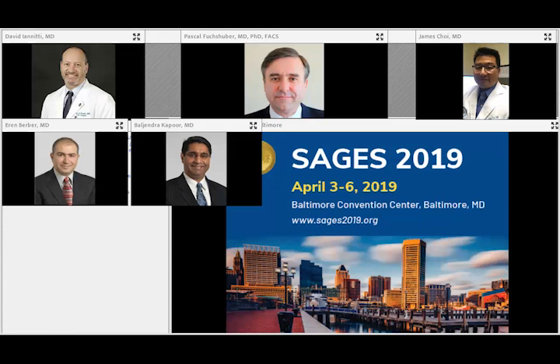All right. Dr. Berber, do you have any size limit? Well, I would say that based on the clinical indications, you might treat large lesions as well. But realistically, I consider 4 centimeters a realistic size limit for myself now, unless the patient doesn't have any option and debulking is the way to go in that patient. Dr. Kapoor? Exactly, same thing. Usually about 4 centimeters. If I'm planning a combined treatment like chemoembolization with ablation, then I can go up to 5-6. It's just a different algorithm, but otherwise, I try to stay below 4.